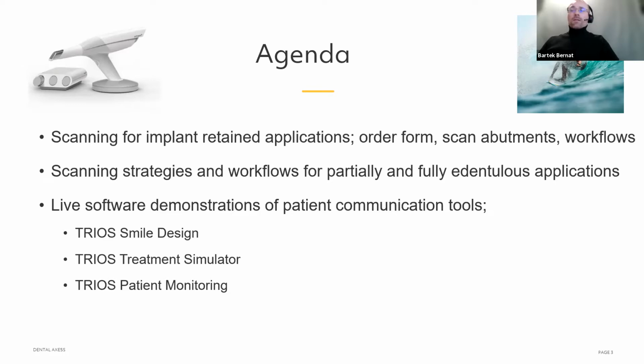This is quite a big one, so prepare for that. And last, I'm going to talk about some exciting apps, as Preshape used to call them, which are TRIOS Smile Design, TRIOS Treatment Simulator, and TRIOS Patient Monitoring. I'm going to base this on this presentation. However, I'm going to switch to the TRIOS running in the background here and do some scanning, showing you some information that needs to be shown in the live system. So let's get started.